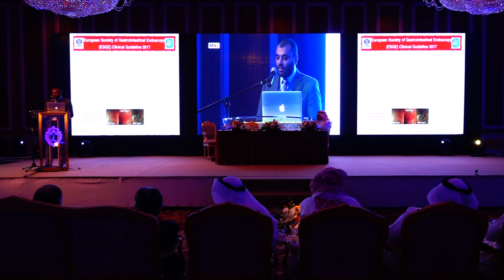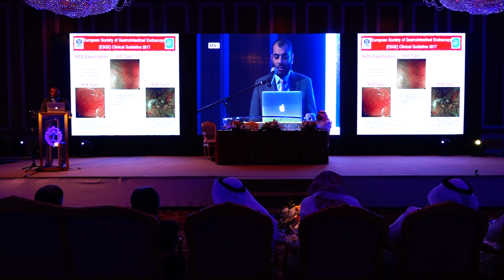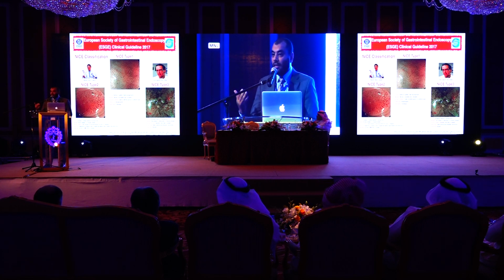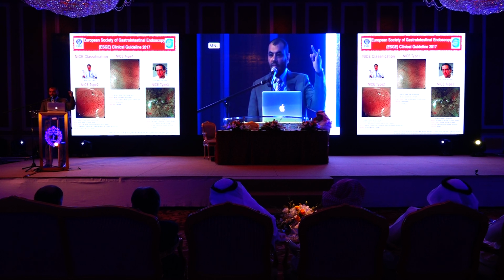At the 79th annual meeting of the Japan Gastrointestinal Endoscopy Society, they initiated a group called the Colon Tumor NBI Interest Group, whose members include Dr. Sano and Dr. Tanaka. This group provided our classification, and the key advantage of this classification is that it can be applied with or without optical zoom magnification. So we can use it here without magnifying endoscopy. They classify colonic lesions into 3 types according to vessels, surface pattern, and color.